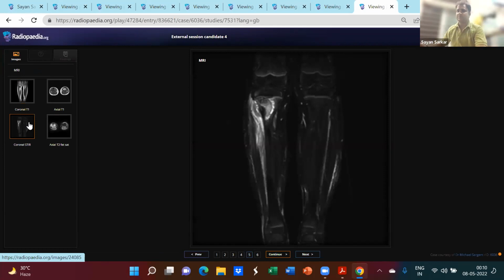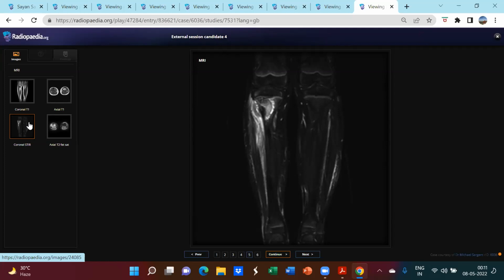I just want you to tell me what are the things that you see on an MRI normally? What are the things that you try to see? I already told you once, but I just wanted to repeat them from you. Yes. So the extent of the disease, the local extent of the disease. The involvement of the neurovascular bundles. The surrounding soft tissues. Anything else? Anything that can help you in the surgery? Well, we've talked about the neurovascular bundles and the extent of the disease, apart from the things that we have already talked about.